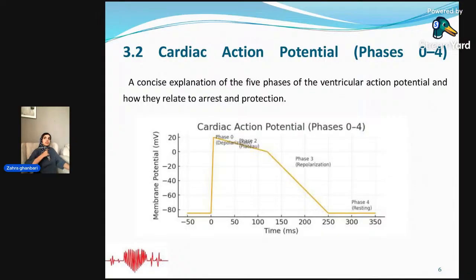I will talk about this solution completely in the next session, but I think it's better to say a point here. For blood cardioplegia, the normal range of potassium is around 20 to 30 MEQ per liter, and for crystalloid solution, it is around 25 to 30 MEQ per liter.